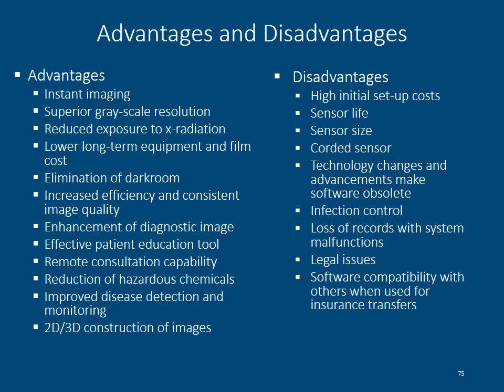There is a lower long-term equipment and film cost with using digital, but the initial startup is quite expensive. It eliminates the space and the chemicals for a darkroom. It increases the efficiency and the consistency of image quality. It enhances the ability for diagnostic imaging because the image can be enlarged to view. It serves as an effective patient education tool because you can increase the image and show it on a monitor to your patients. It is also used with remote consultation.